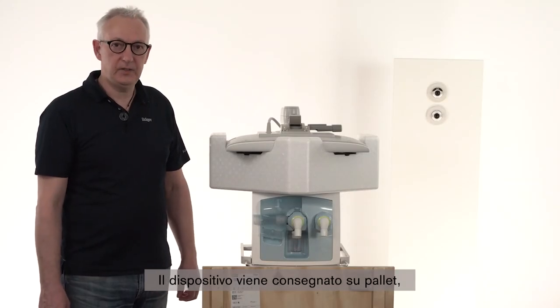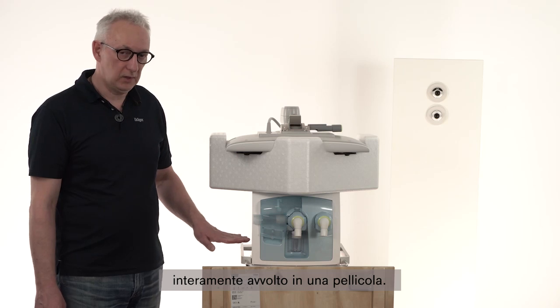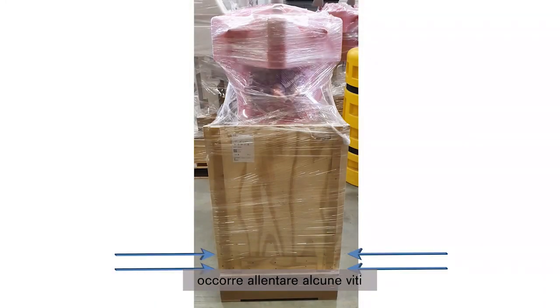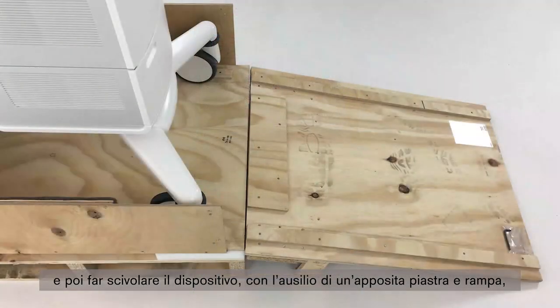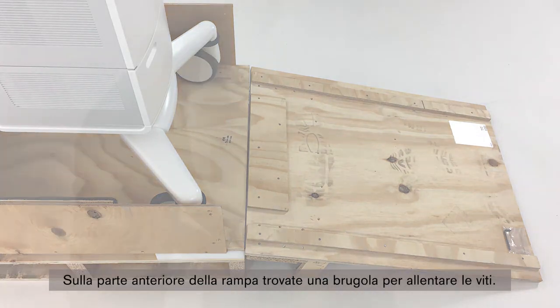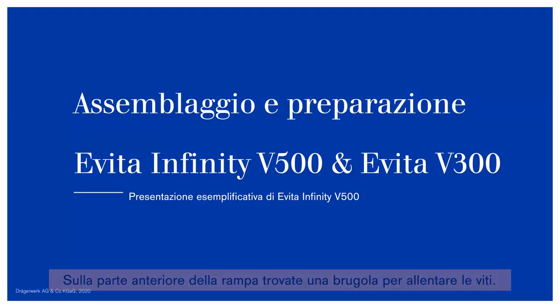The device is delivered on a pallet. The complete device is wrapped with a foil. To unbox your device from the pallet you must loosen some screws, and then you have a specific plate and ramp that you can roll up your device. In front of the ramp you find a specific tool to loosen the screw.